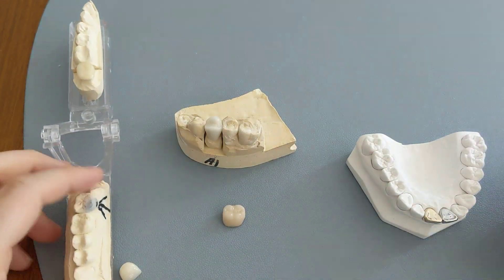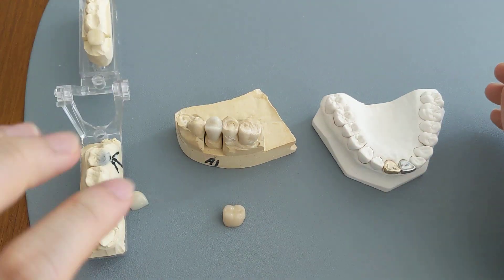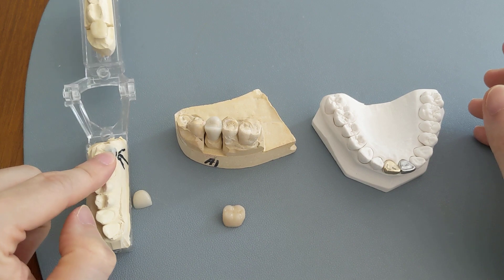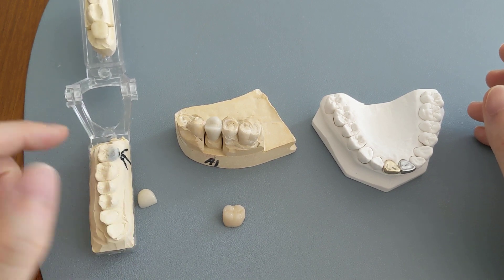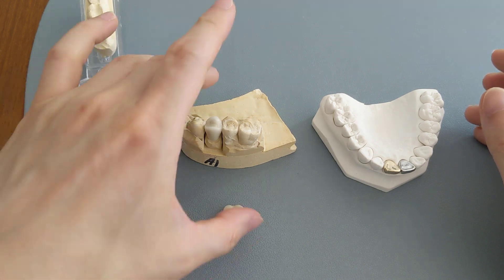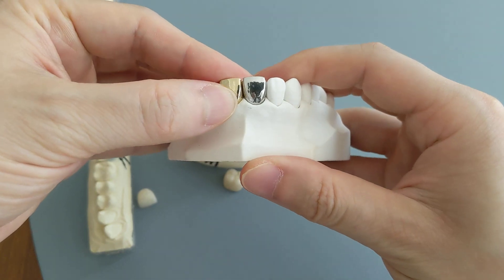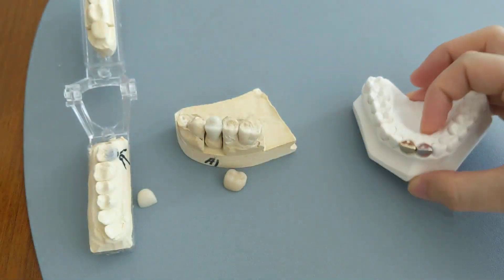So those are all the different types of crown materials that you can get. To recap: you have the all ceramic ones — popular types of material include Emax and Zirconia. Then you have the PFM crowns, which are the porcelain fused to metal. And then you can also get gold crowns and all-metal crowns.